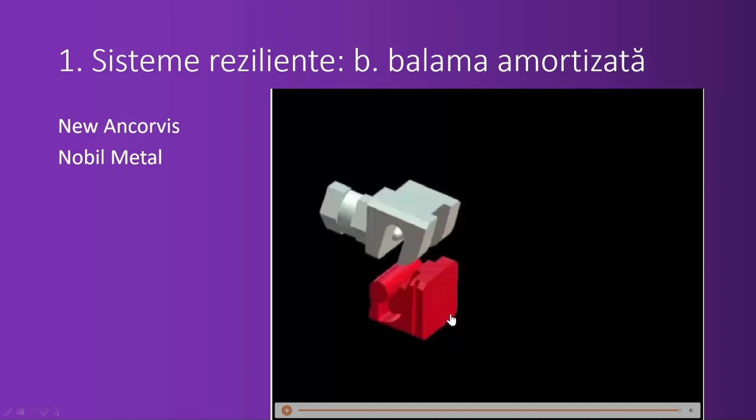But this is difficult. You see, this red thing is very difficult to cast, because you have to have a perfect match between the two parts, the fixed and the mobile. If you do it in gold, well, you can do it, but is gold strong enough? That's another discussion. For this one, together with a noble metal, I've devised a system with a notch there.